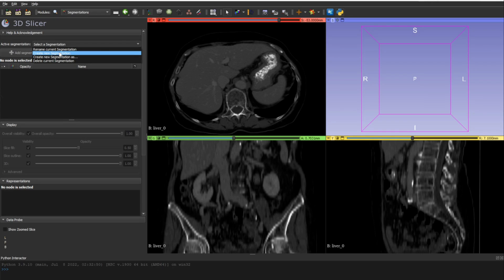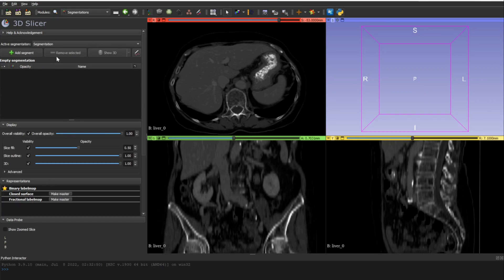Now we have our new segmentation created. Let's create a new segment. The segmentation is the file — it can be NIfTI or NRRD — and the segments are the masks inside it. If we have one class we have one segment; multiple classes means multiple segments, but only one segmentation file for the whole scan.